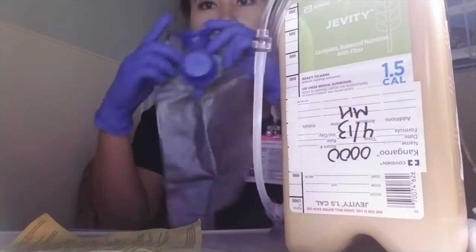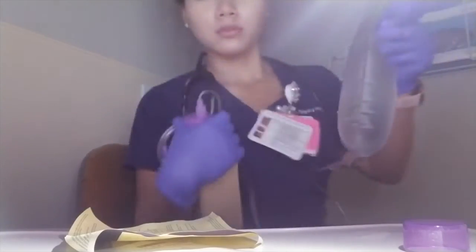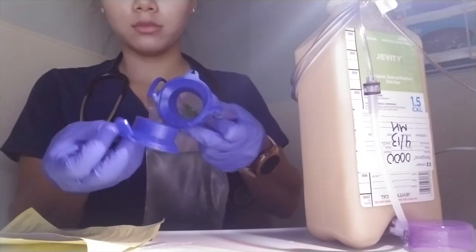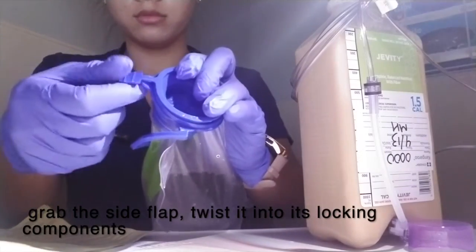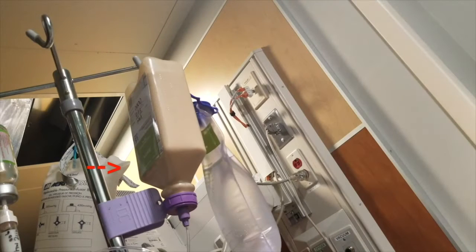I will now grab my flush bag and fill it with water. Close the top and secure it by pushing it into place, then grab the side flap, twisting it into its locking components. I have now hung my formula bottle and flush bag onto a pole.